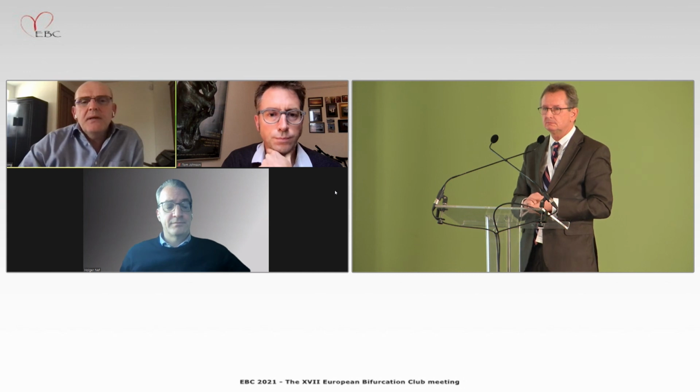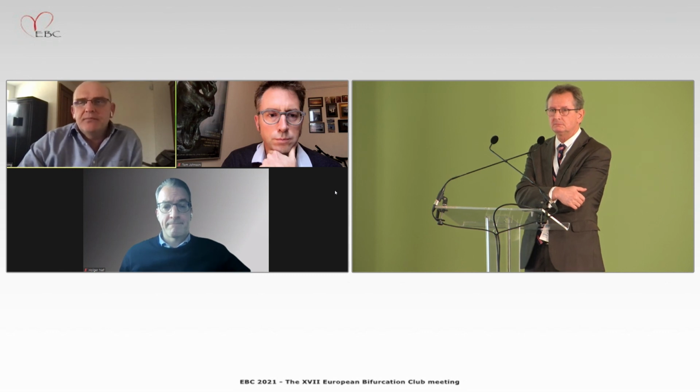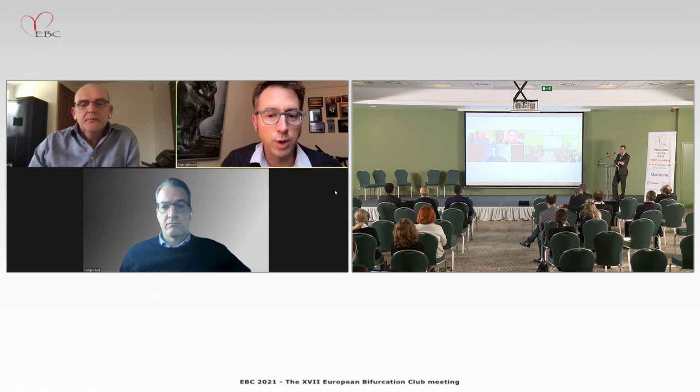Finally, Tom, if you were treating a calcified bifurcation, would you routinely use lithotripsy in both the LAD and diagonal? Would you use the balloon in both branches straight away, or would you be differential about that? I would be entirely guided by the imaging, I have to say, Adrian, which is the approach we've now adopted, having, with the arrival of IVL, institutionally agreed that we would increase our imaging use. That's led to a more intellectual process as to how we should be treating it. And Marek highlights it's another tool. It's been the most instrumental tool, but it is one of a number that we probably have to institute.